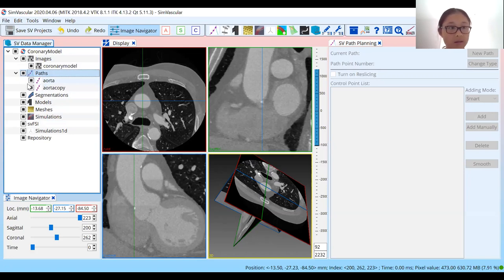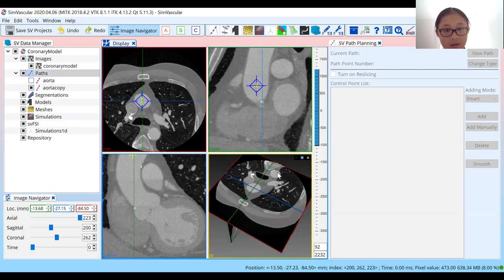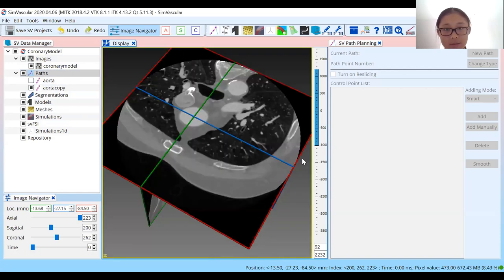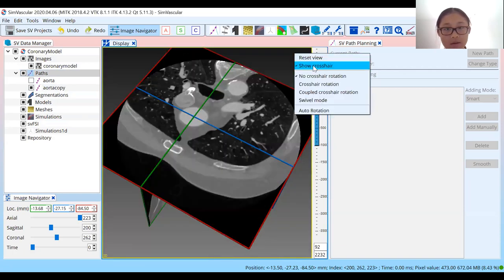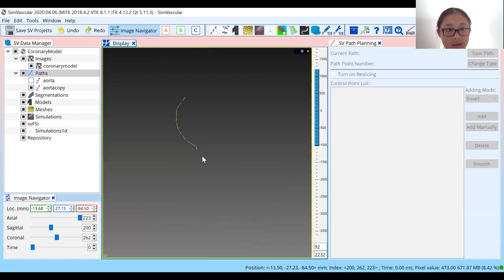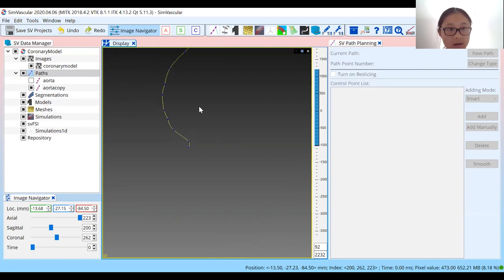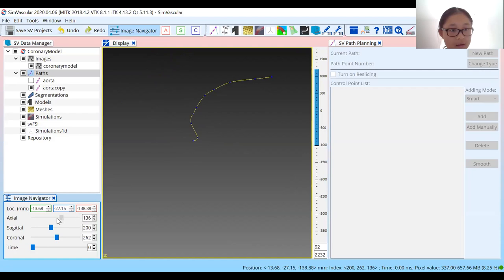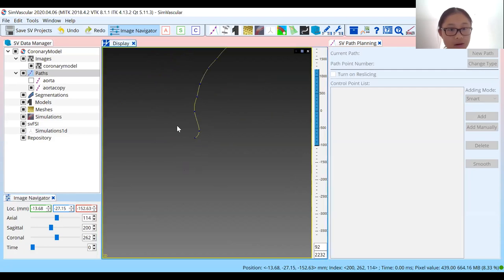I'm going to hide this aorta that I was working on so I can see the imported one. Just unselect that and you'll notice that the aorta copy, or the one I imported, is now more visible. I'm going to show you what the imported one looks like — so enlarge the view, turn off crosshairs. You'll see that we've plotted out the aorta here.